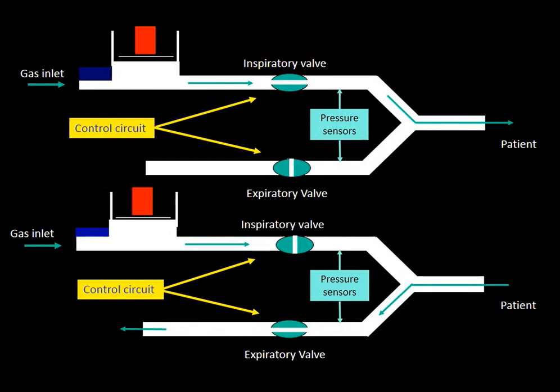So, in essence, I think it is important to understand what the ventilator is and how the ventilator works to understand the principles of mechanical ventilation. The ventilator is a system that delivers a flow. Whatever setting we apply on the ventilator, whatever number we change, the only physical entity on which the ventilator can act, and this is in the name itself, is the flow.